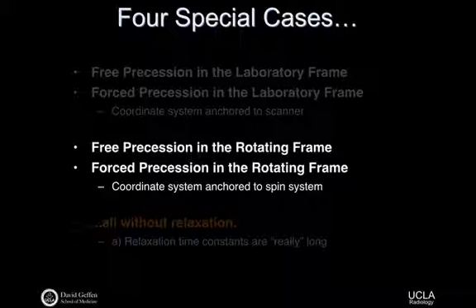Now that we've defined these two terms, just for bookkeeping, I'll write that my B effective is just equal to the B1 envelope function as a function of time along the I hat direction. So now we've gotten through these first two steps. The last thing we want to do is at least define the equation of motion and then talk about solutions. That's our goal. How do we describe the bulk magnetization once we know what the governing equation is?